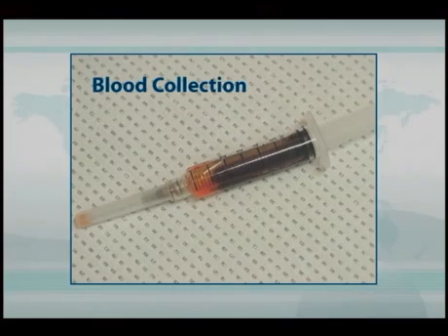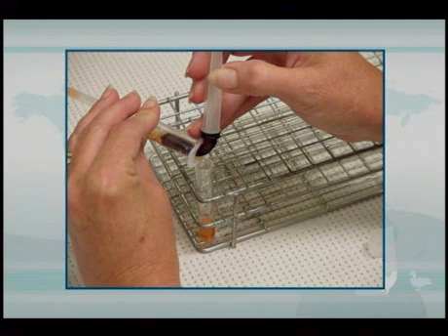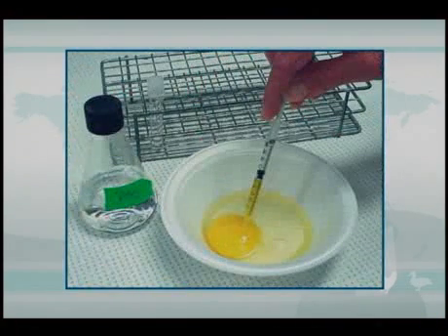Then the following morning, often that clot will adhere to the rubber of the plunger, and you can just pull the plunger out from the back of the barrel and pour the serum into a vial. In most cases, the vial will not even require centrifugation because most of the red cells will be retained in the clot. So this is a good way to collect serum from birds. But there are many other ways as well.